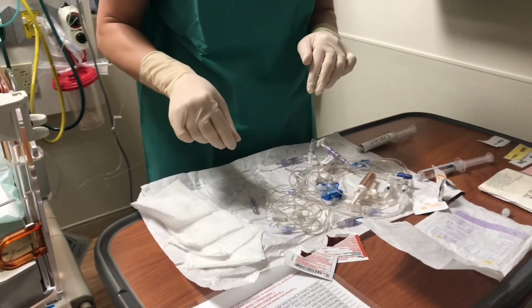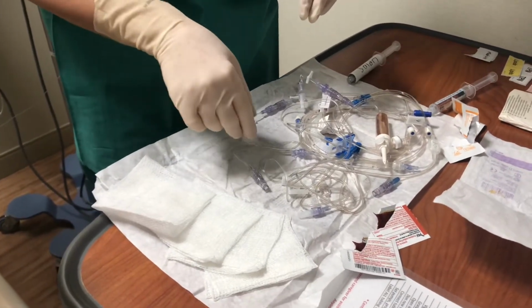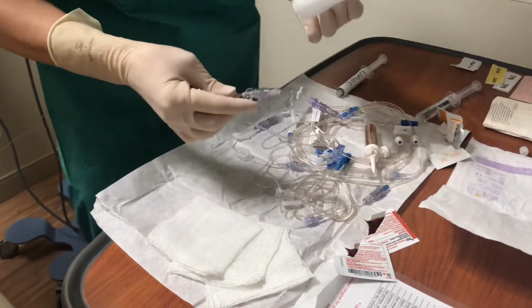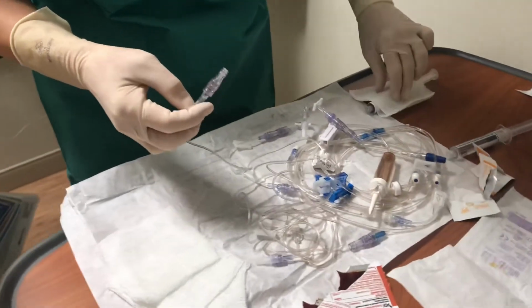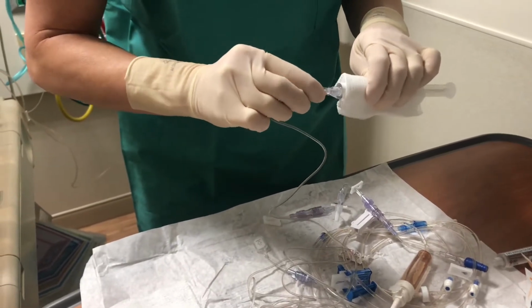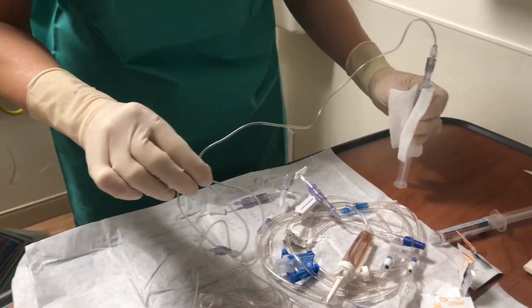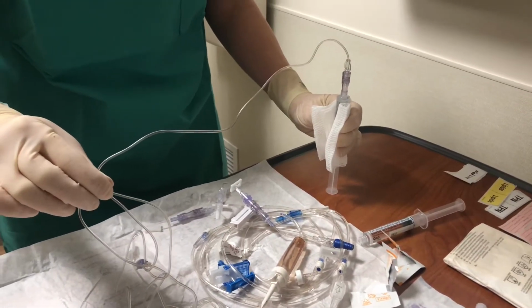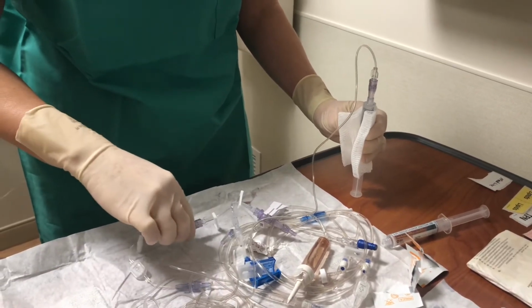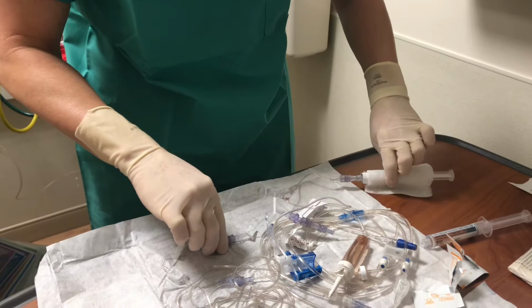Here's where I will grasp my syringes using a sterile 4x4 to attach to the clave on the end of my lipid tubing and my med tubing. I'm going to take one of my sterile 4x4s, and I'm going to grasp my lipid syringe, and I'm going to attach that to my clave at the end of my lipid tubing. And then I'm going to use the table, and we're imagining we got our white lipids there, to prime through my lipids, through my filter, to the end of the clave. And then I'm gently going to put my syringe down back on the table.